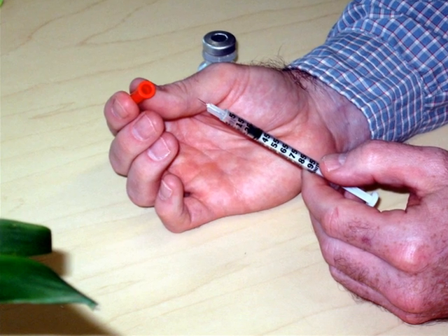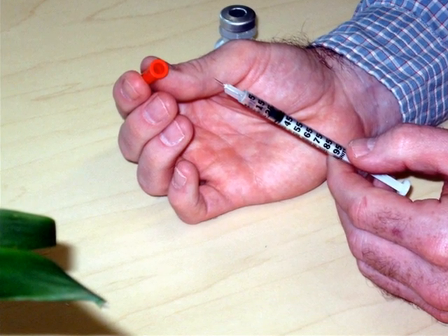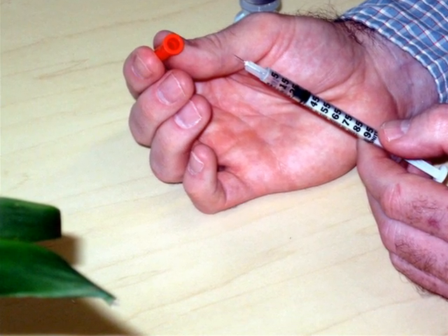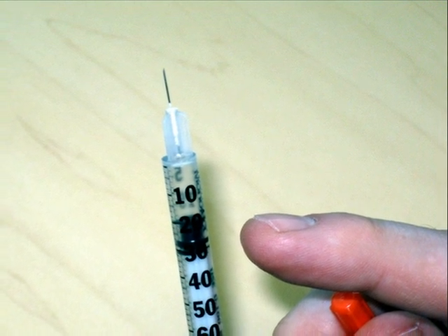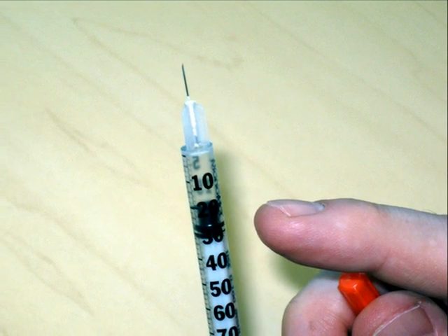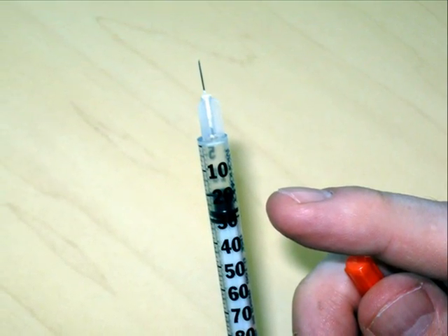Now, take the syringe, remove the orange cap, and draw air into it equal to the dose of insulin that you will be injecting. In this example, we will be using 20 units. Pull back the plunger until the end of the black stopper rests just below the unit level of 20 on the syringe.